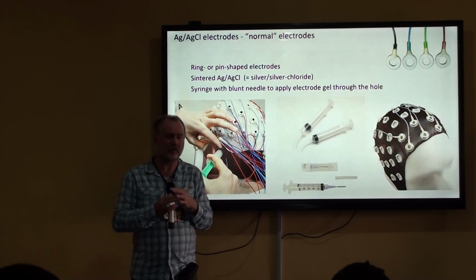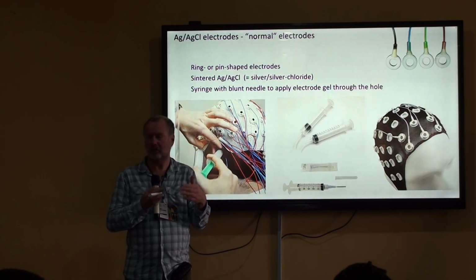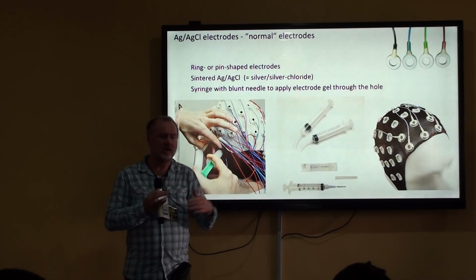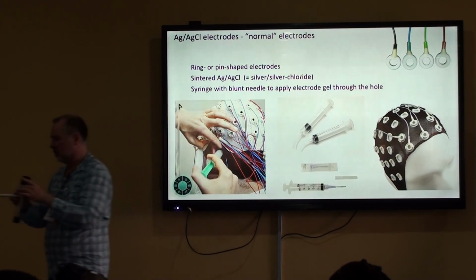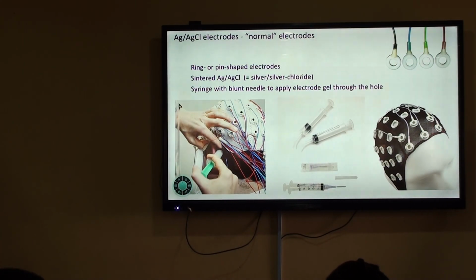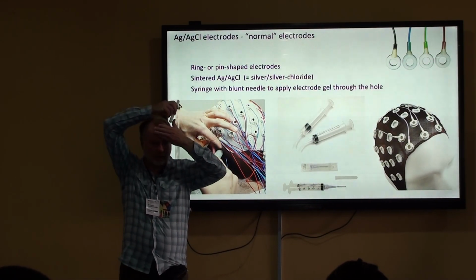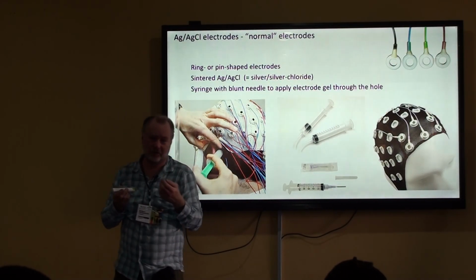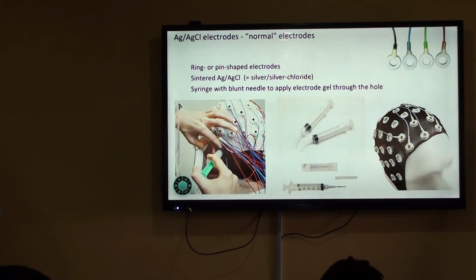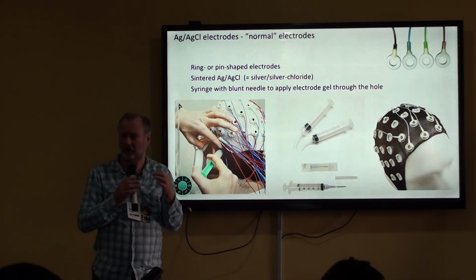So we're not going to tell them that we're going to use a needle. We're just going to approach them from the back. There's no mirror. We would sometimes block their eyes. So if this is the syringe, we would approach from the back, block their eyes and basically do it like this, because kids can be really scared of needles. With adults, we just tell them that the needle is not going to puncture your skin.